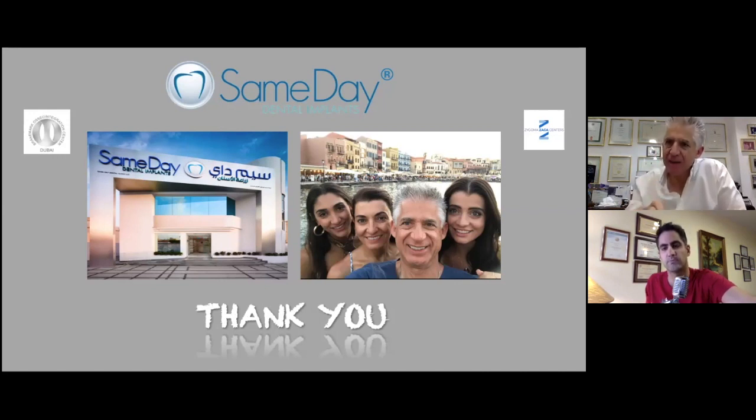If we're talking specifically about zygomatic implants, is Straumann available in Iran? Yes. Okay. Straumann, in collaboration with Southern Implants, has just brought out zygomatic implants. The implants are manufactured by Southern Implants, but they're marketed by Straumann with the Straumann label. And those implants also have a 55 degree head, a built-in angle. They are a modification. Their body is a little bit different. In Carlos Aparicio's opinion, they are optimized.